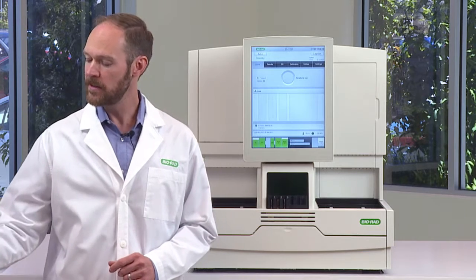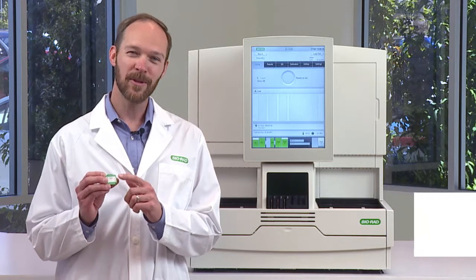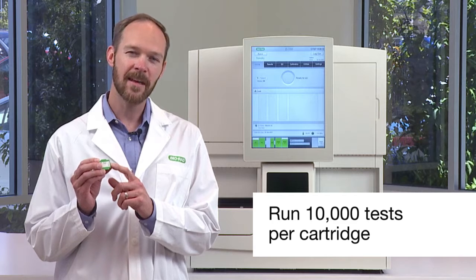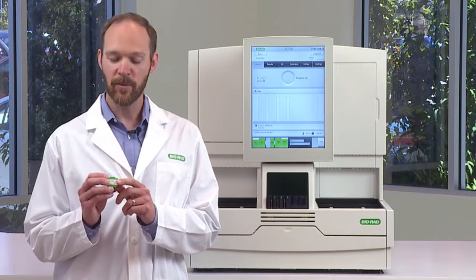The first thing we'll talk about is the D100 analytical cartridge. The cartridge holds the HPLC column where the hemoglobin separation occurs. This little cartridge is good for 10,000 tests, so you really don't have to change it very often. But when you do, it's a very simple operation.